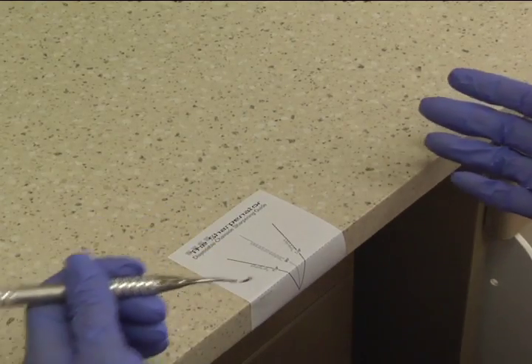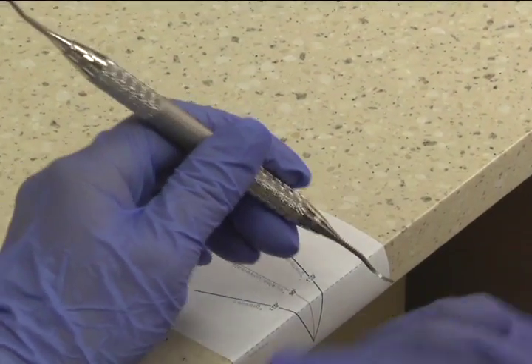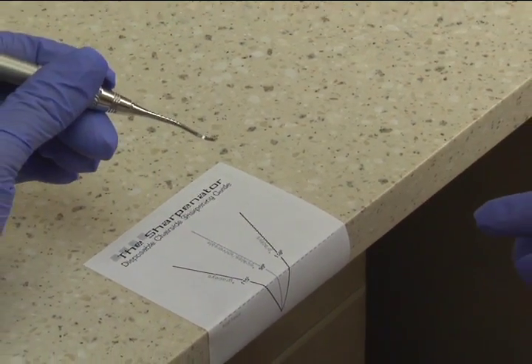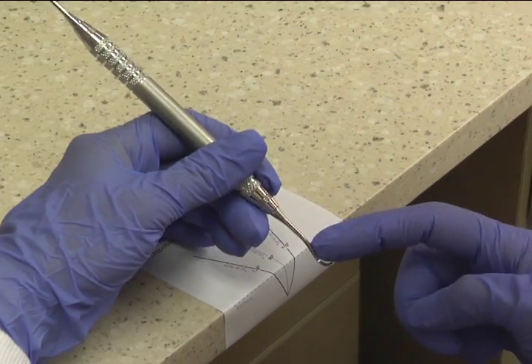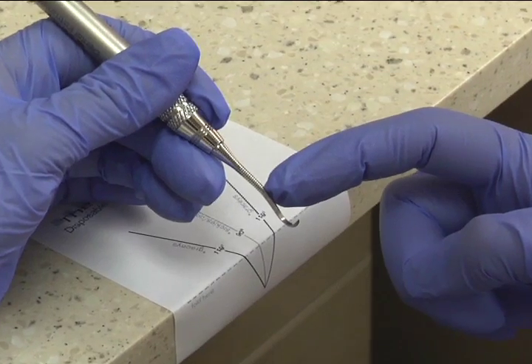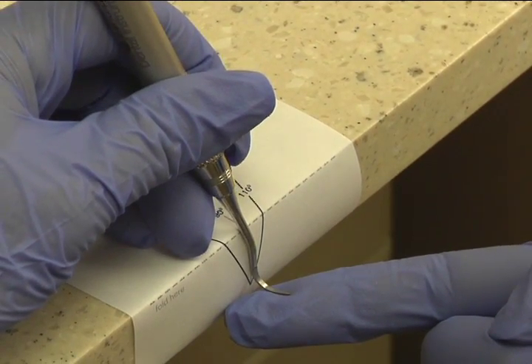So we are going to start with the anterior sickle. I'm going to make sure my arm is resting comfortably on the countertop. I'm going to hold the instrument in my non-dominant hand, and I will be positioning, this is an H67, so the terminal shank is this part here. It's where the blade ends to the first bend in the shank. So I'm going to put this terminal shank right here at the 90.